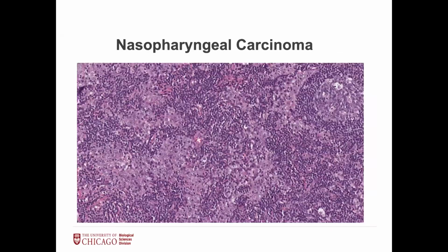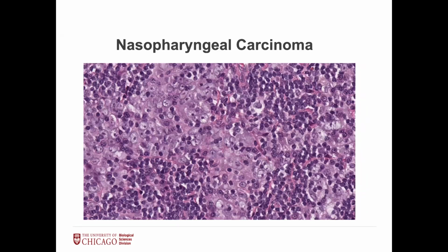Non-keratinizing is going to involve epithelial cells. Do not miss this when someone sends, let's say, adenoids, right? So you'll be thinking, germinal center, blah, blah. Sometimes it can be hard to see if they're worried about a mass. If you're having a hard time seeing, is this inflammatory cells? What is this? Is this a lymphoma? Do your whole IHC workup and the EBV in situ hybridization, because this could obviously be a lymphoma as well.